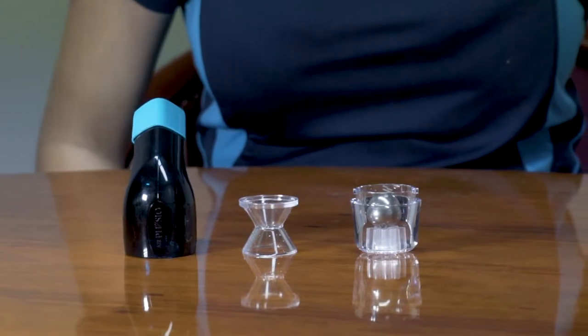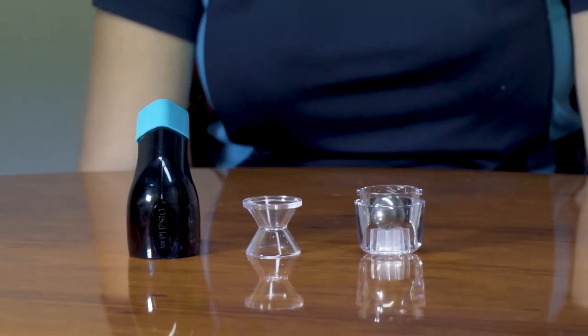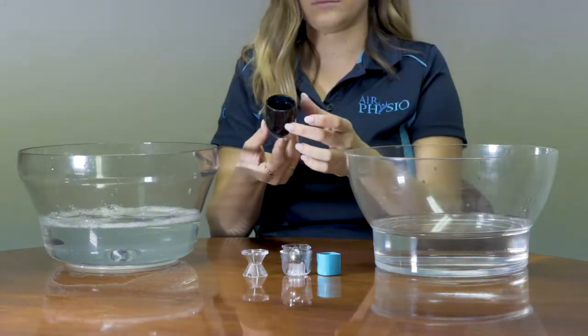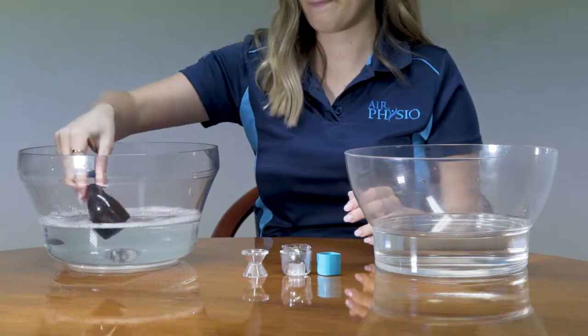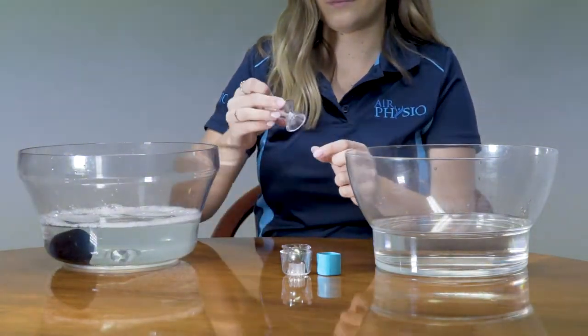Washing the Air Physio parts. Once the Air Physio device is fully disassembled, pick up each part and inspect for damage. If there is any damage to any of the parts, please contact Air Physio or your local distributor straight away.